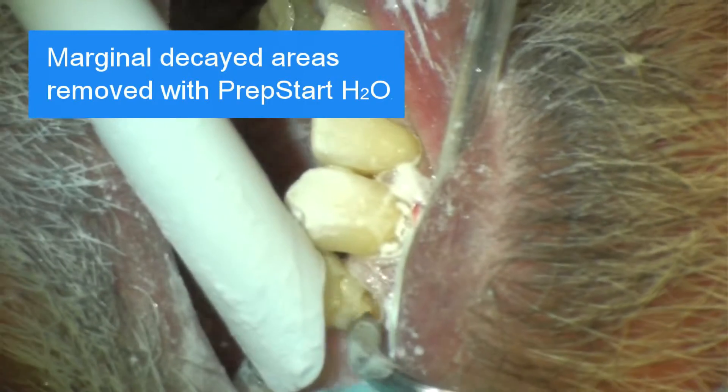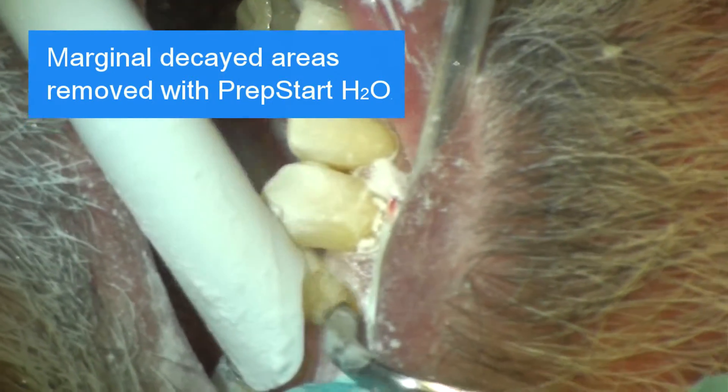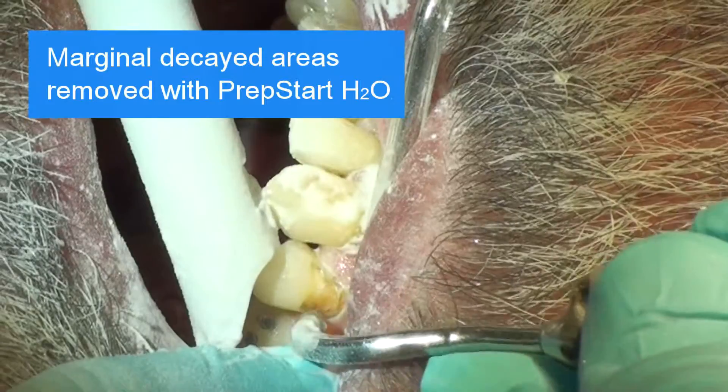Two Class V restorations with marginal decayed areas are being removed with air abrasion without anesthesia.